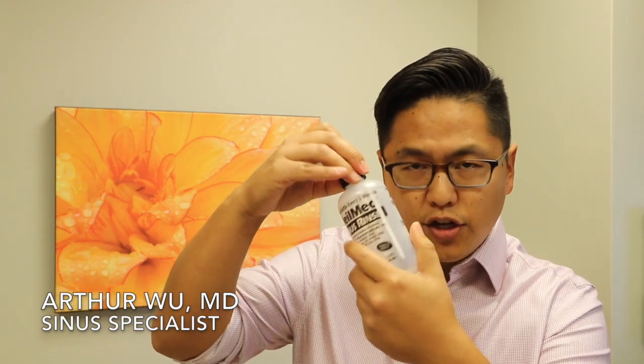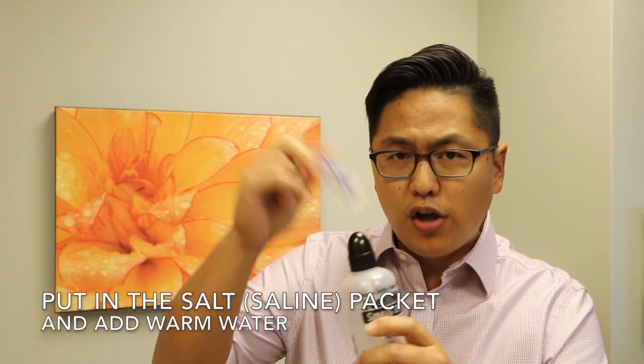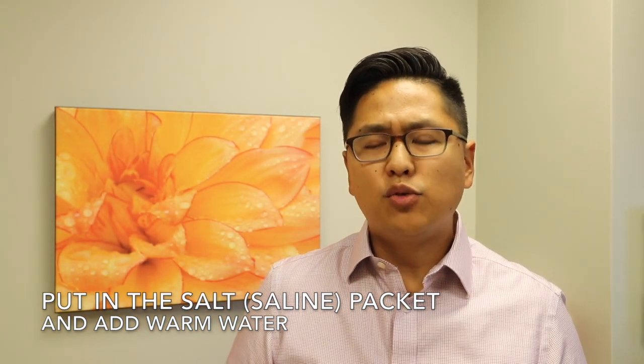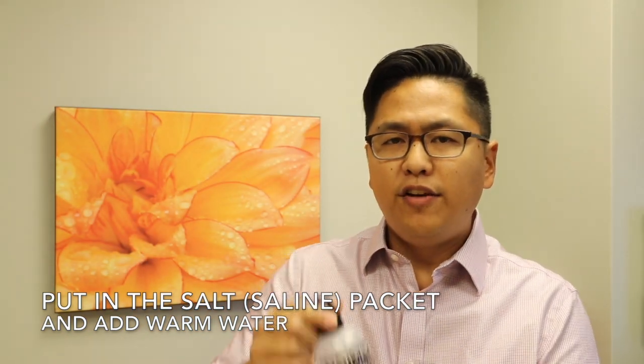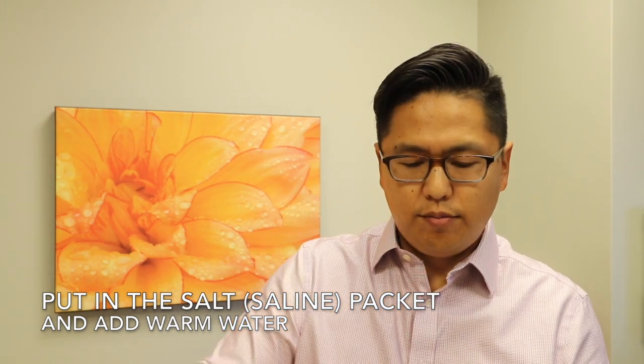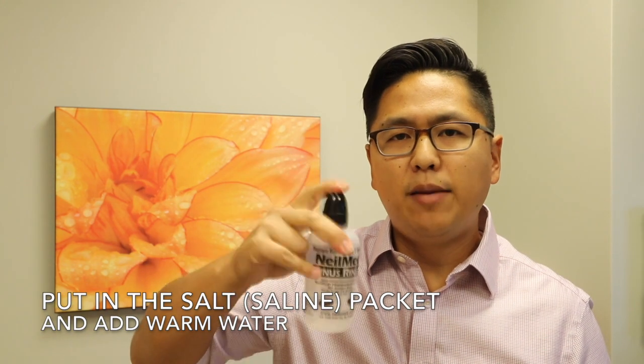Let's talk about how to put the rinse together. You're going to take your sinus rinse bottle, undo the top, and put the salt packet inside. If you don't put the salt packet, your sinus rinse will actually burn. Fill it to the dotted line with barely warm water, put your finger on top, and mix it about.